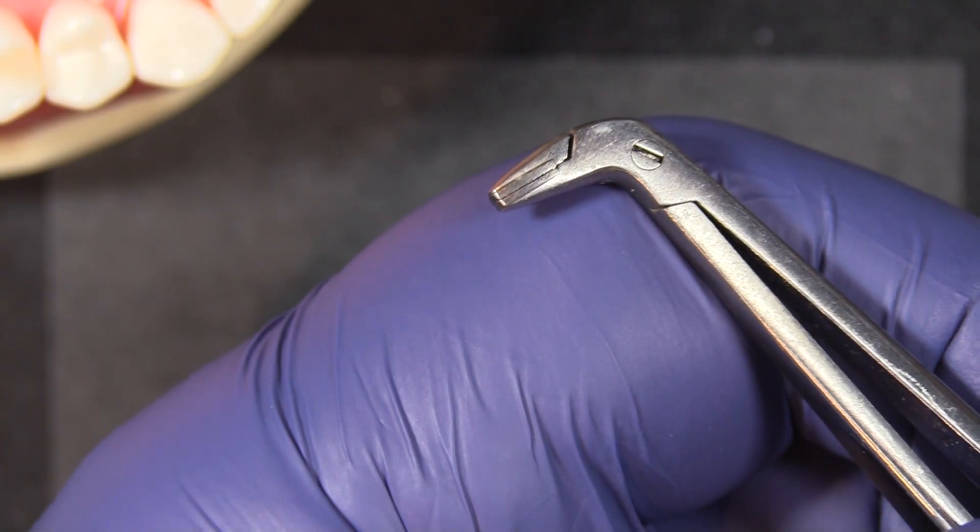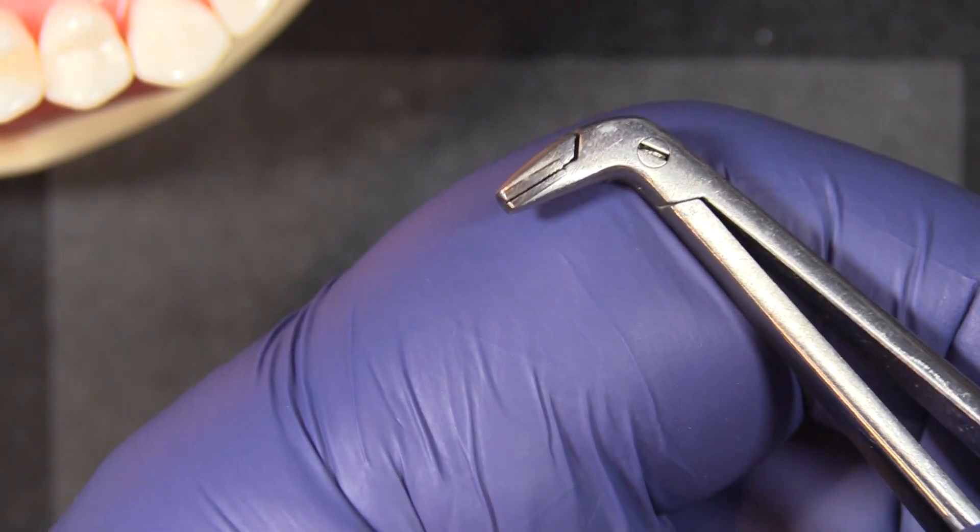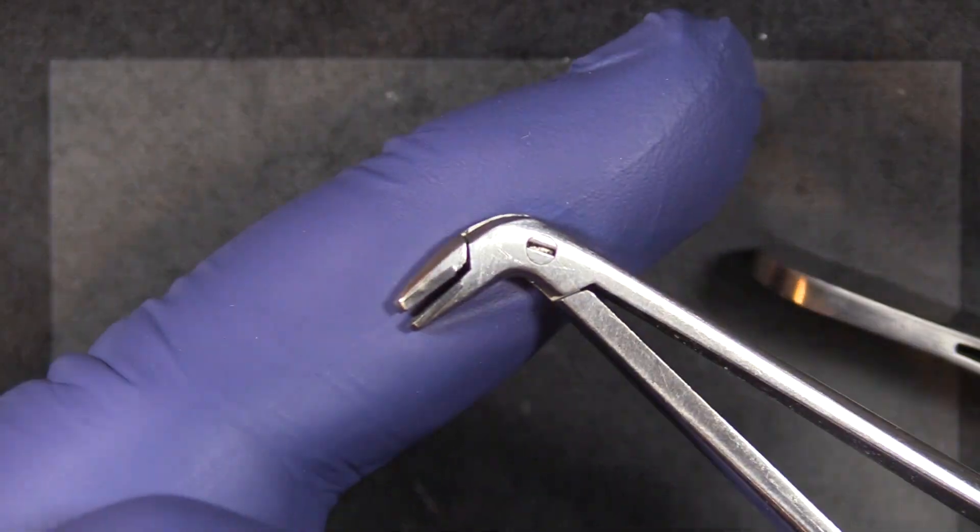They're interdigitating carbide teeth, so they fit together like regular teeth in a mouth and they create an incredible grip for removing the bands from a tight contact.